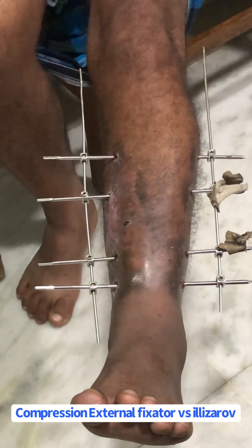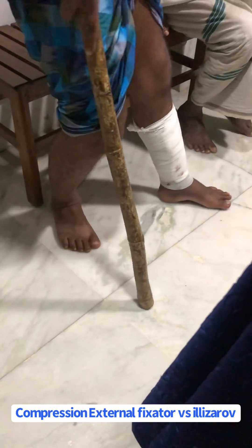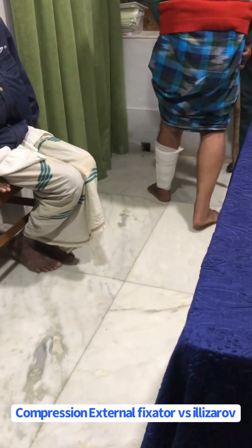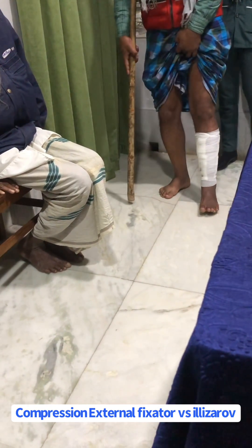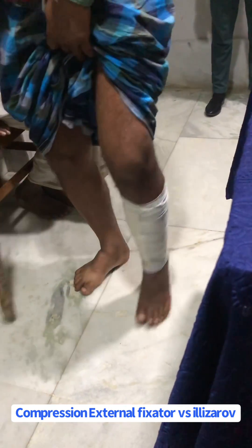One thing that needs to be emphasized is that a compression external fixator is better than Ilizarov — it is less cumbersome, failure rate is less, expense is less, and the patient can do his normal routine work comfortably. And you can see he is walking comfortably after removal of the fixator.